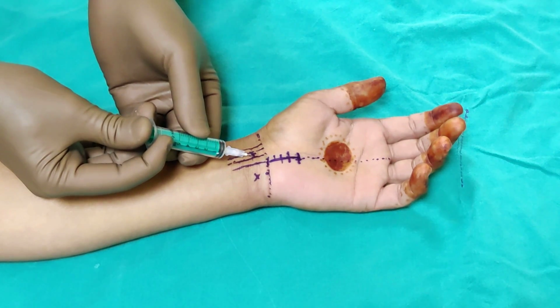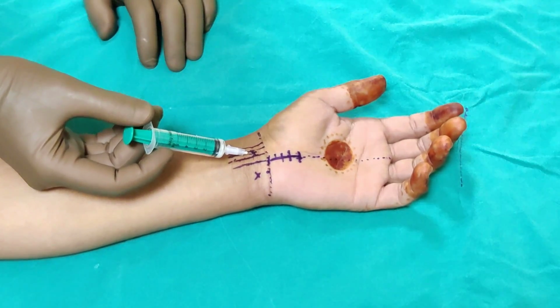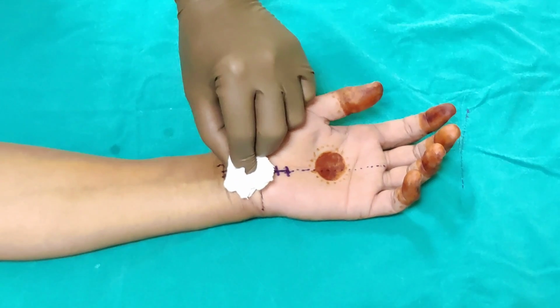It's always a good idea to aspirate and then go slowly. So as you can see, the patient has got some pain, but it's not a very painful procedure. So this is our injection done, and this is how you inject a carpal tunnel. So this was a demonstration on how to inject carpal tunnel with a combination of lignocaine and steroid. If your symptoms get better, even if they come back, it is usually a good prognostic tool. Patients who have got their symptoms better with steroid do very well after the surgery.